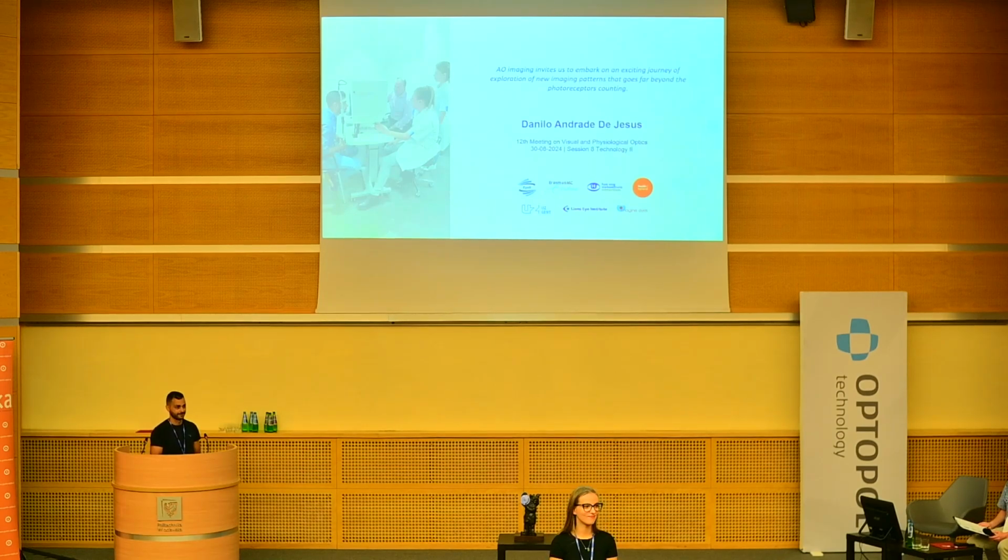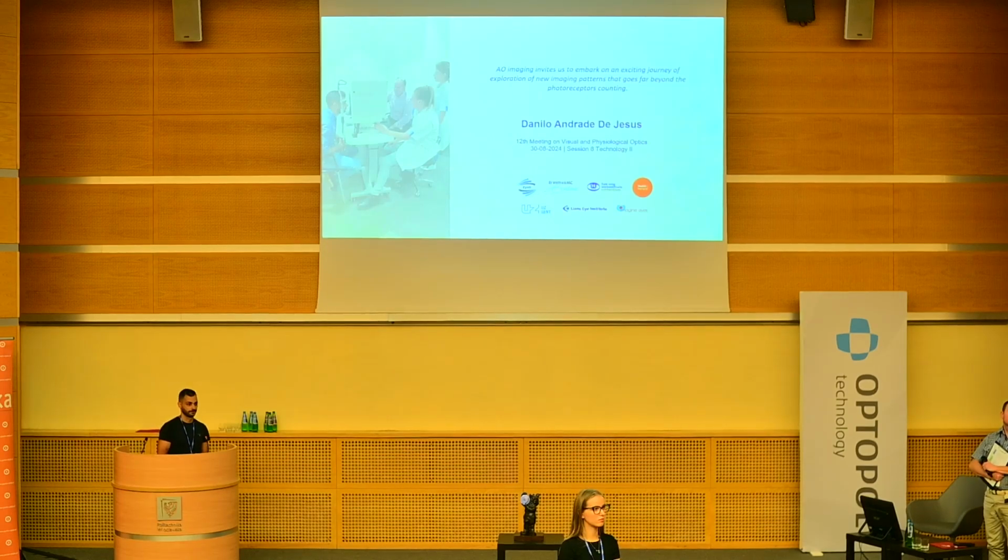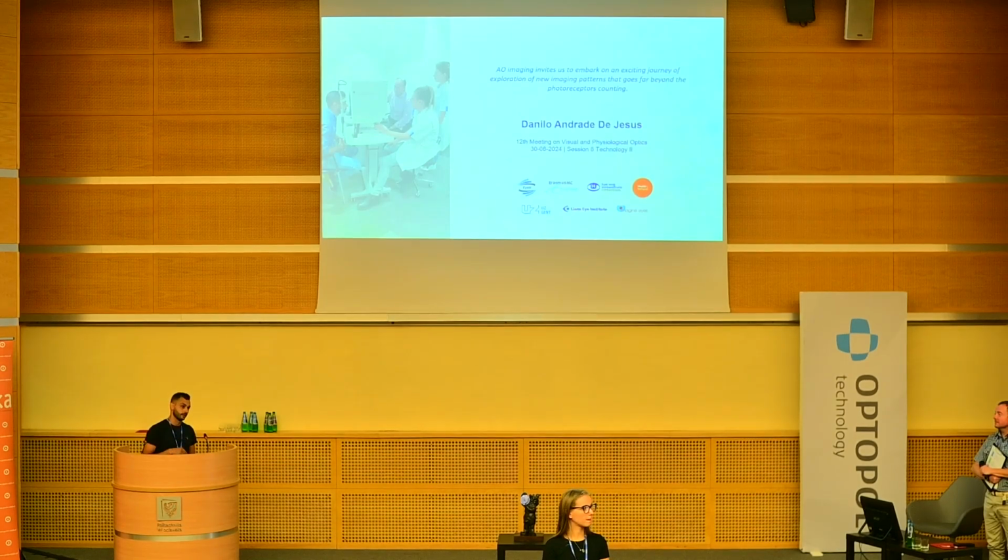Okay, thank you very much. I think that it underlines the current opinions in the bibliography that multimodal techniques are the future, because each technique has its own limitations, but if you combine, for example, OCT with some other techniques, you can get something that is very, very useful. And yes, let me just add to that, there is a device, the M2 OCT, that also combines adaptive optics with other imaging modalities, with OCTA, OCT, and SLO, and you can get really nice images from that. Thank you very much.